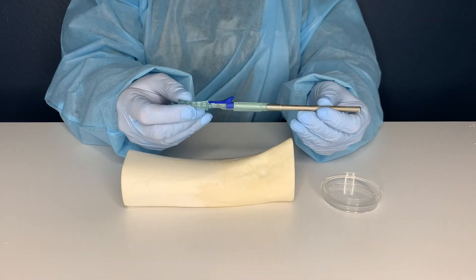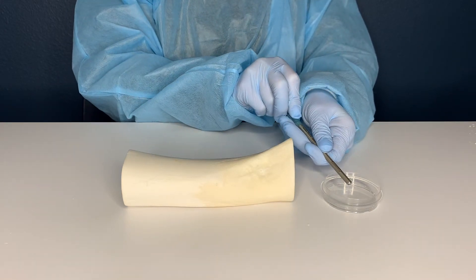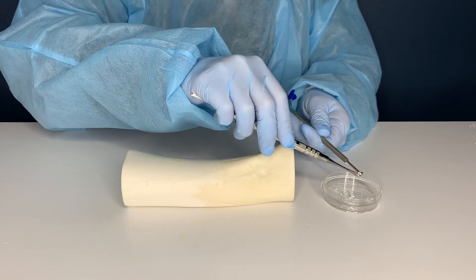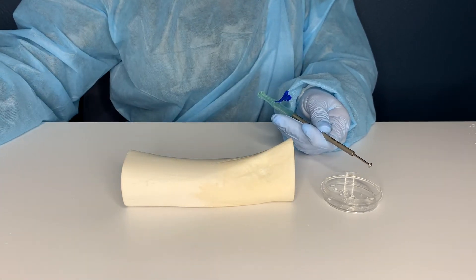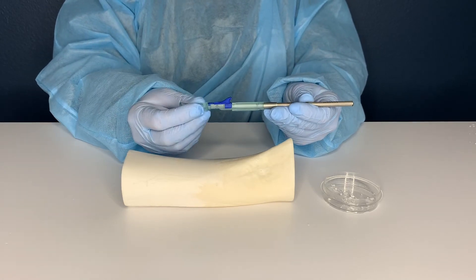To retrieve the harvested bone, lift the blue tab and slide the body of the Micross down. After removing the harvested bone from the Micross, slide the body back up and place the blue tab in the locked position to be used again on the same patient.